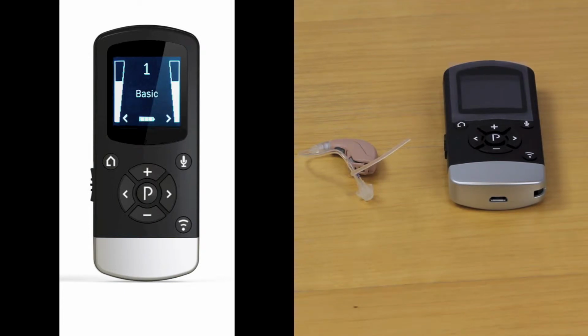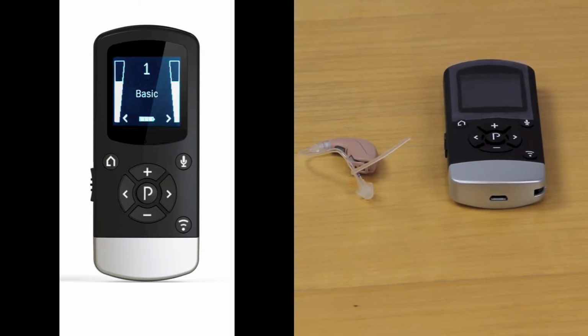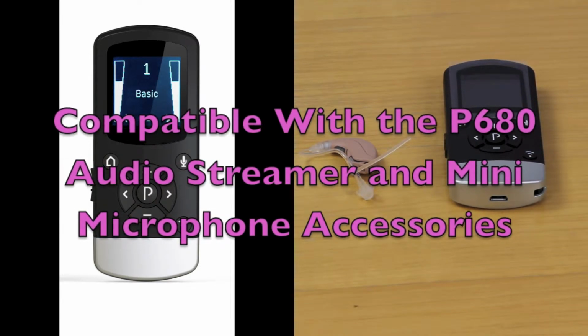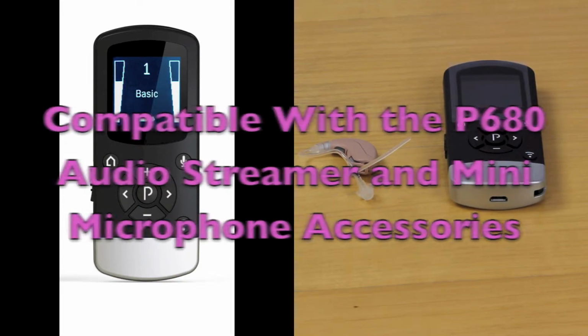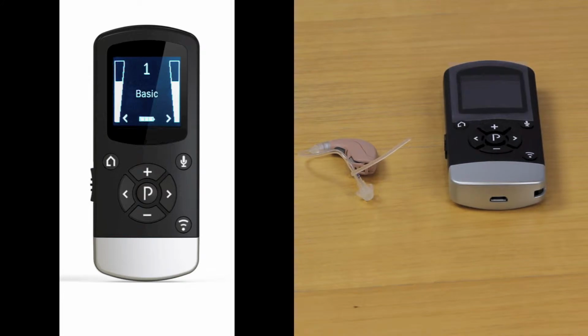The Remote Control 2 may also be used to activate audio streaming for other wireless devices, such as the TV streamer or mini microphone. Ultimately, you should be able to utilise all functionality of your hearing aids without the necessity to use the programming controls on the hearing aids themselves.